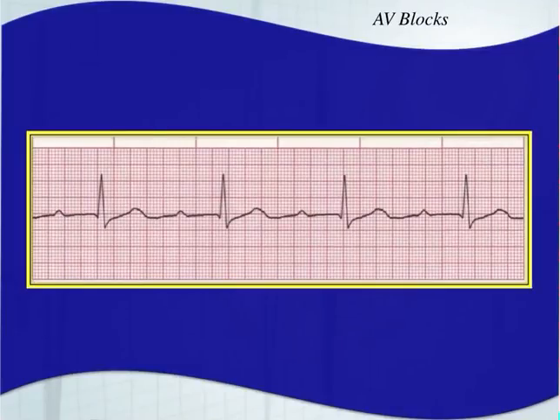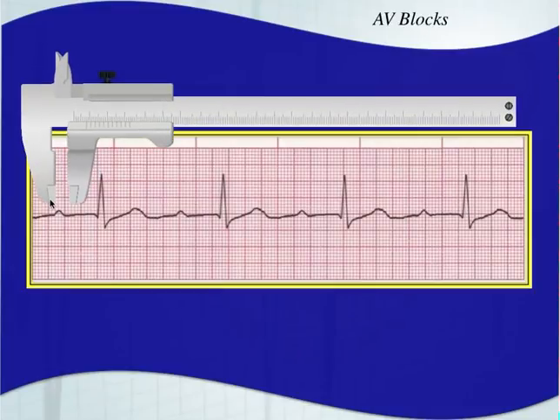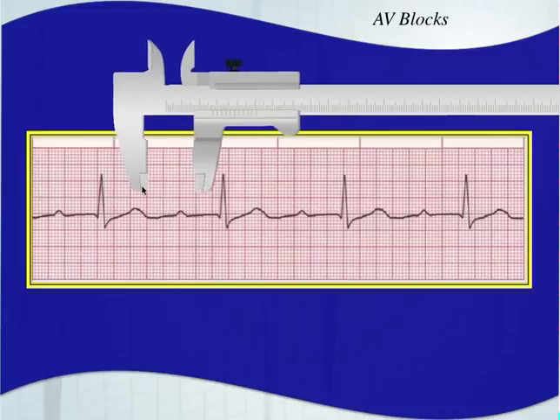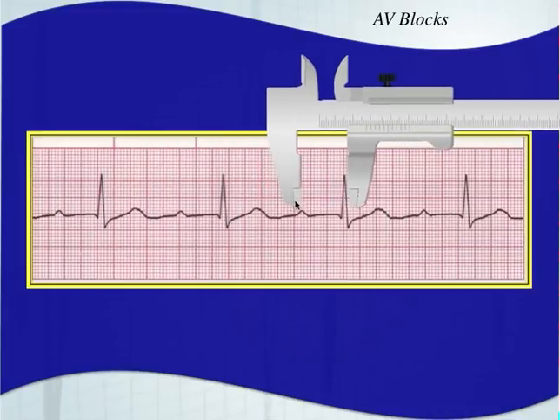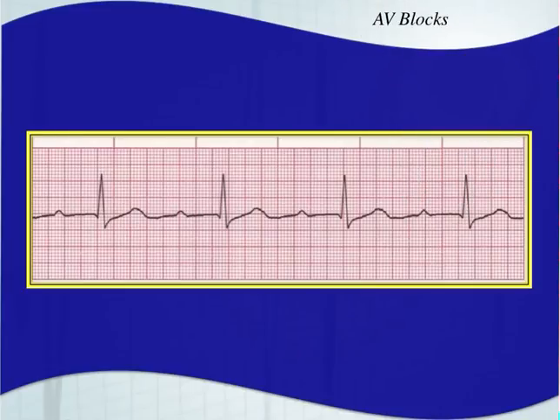Looking at the next one: is our PR interval a constant length? Looking at the strip, it appears pretty consistent. Do we have dropped beats? I don't see any dropped beats and I'm not going to assume there are any since the PR interval is staying consistent. So this would be a sinus bradycardia with a first degree AV block — and that is a very prolonged PR interval.